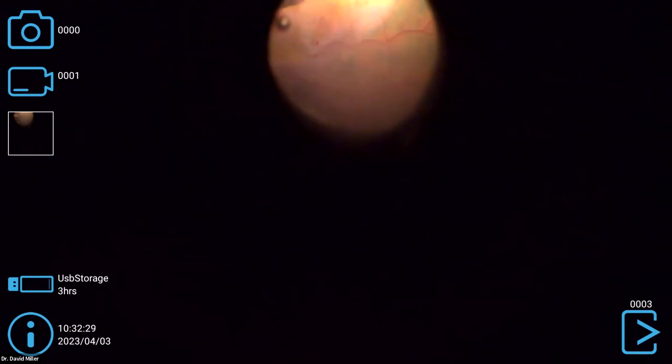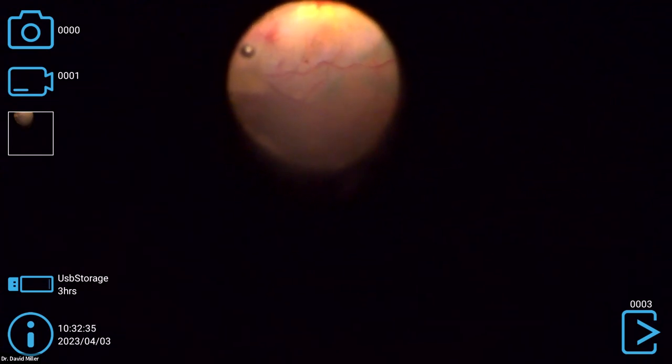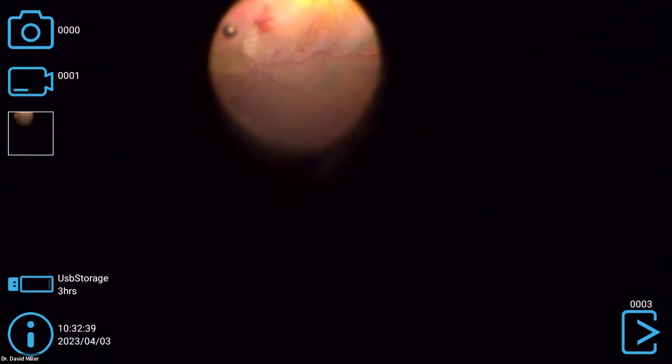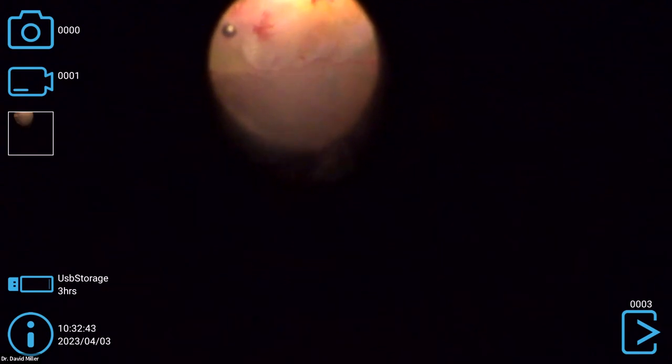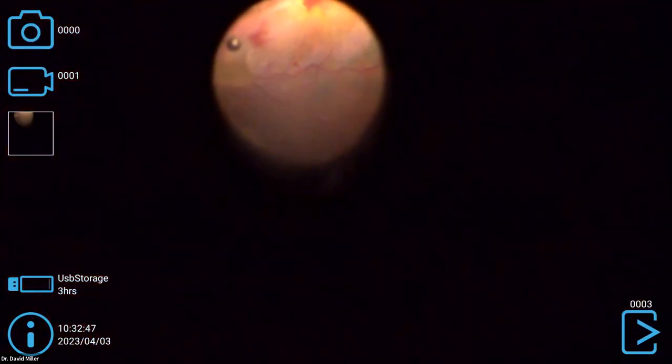And we'll take a look maybe a little closer at that hemorrhage site. You can see how the retina was folded here from the ERM. So we'll let that unfold naturally. We'll take a look at the hemorrhage, make sure we don't have a break there. Or if we do, we'll leave... certainly want to be leaving gas. And maybe we'll leave gas anyhow to help smooth things out. You got a soft tip? I do. Let's try and pop that little macular hemorrhage or see if we can lift that macular hemorrhage up, see what's under there.